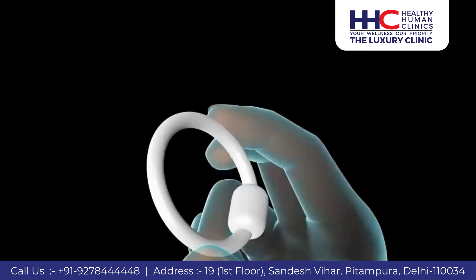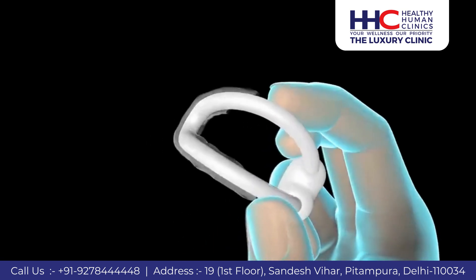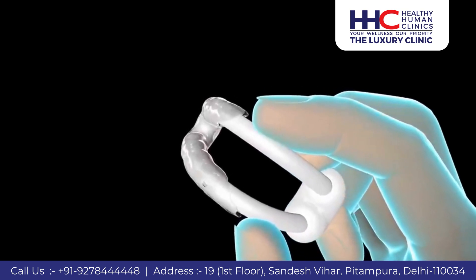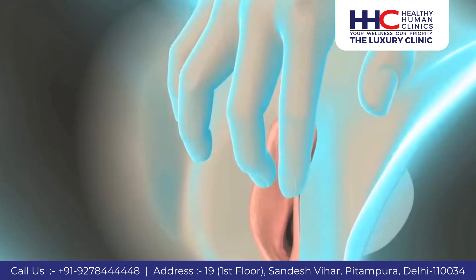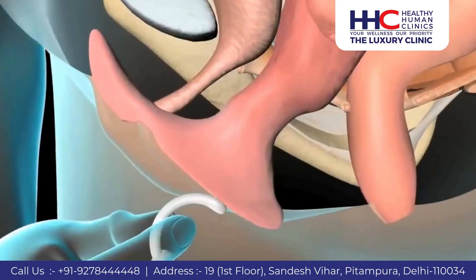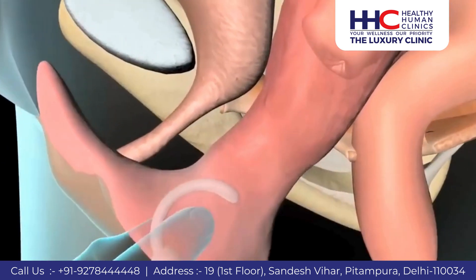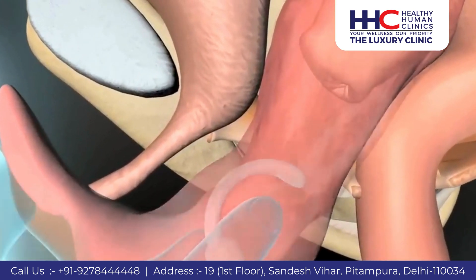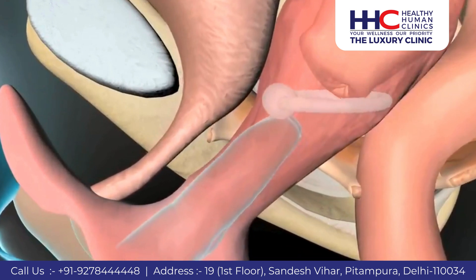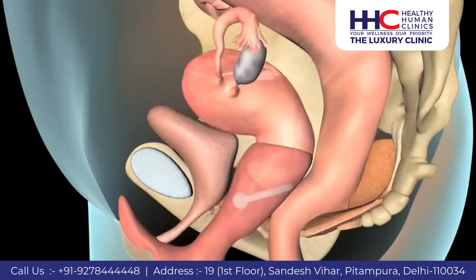To insert a ring with knob pessary, fold it in half. Place a small amount of lubricant on the end without the knob. Use your fingers to spread the labia. Carefully insert the pessary into the vagina as far as possible. Use your index finger to rotate the knobbed end of the pessary upward. You should not feel it once it is in the correct position.